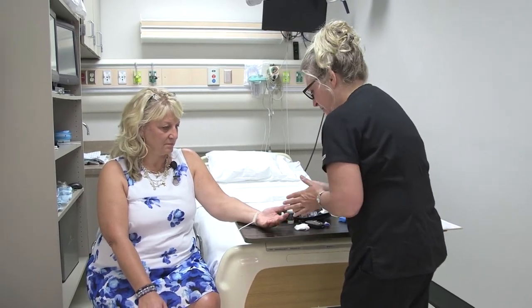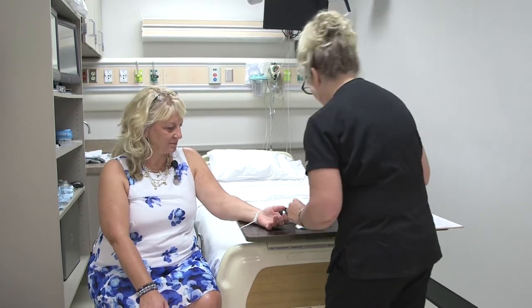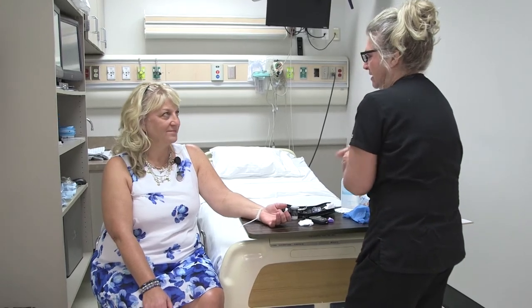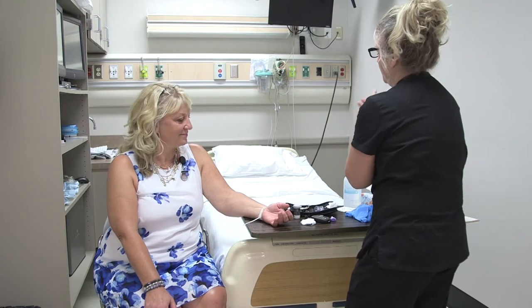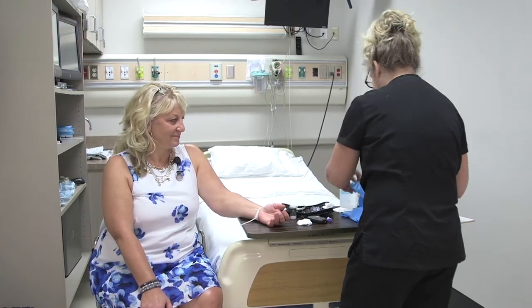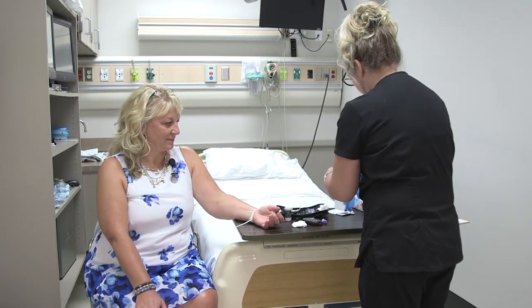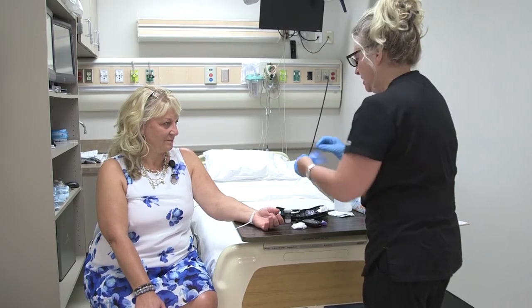I'm just going to check your fingers. Which finger would you prefer that I use? This one. Okay, very good. I'm going to wash my hands again before I put on my gloves. Now I'm going to put my gloves on since I have everything ready to go.